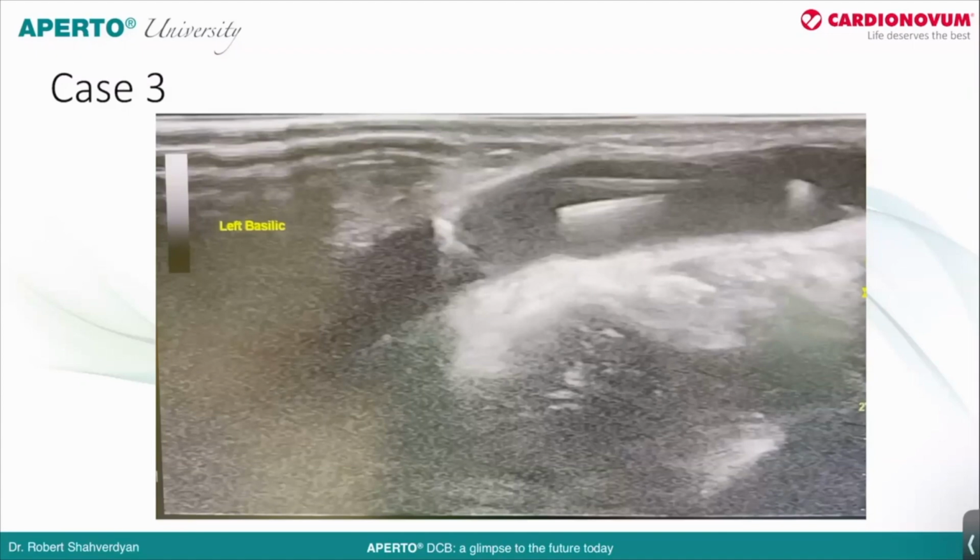And also, if you don't cover it, and probably or possibly extend another lesion at the edge stenosis of a stent graft, you will have a new venous anastomotic location for another graft down the road in the future if the patients need another graft. So you will not completely cover the outflow vein over time if you require it.